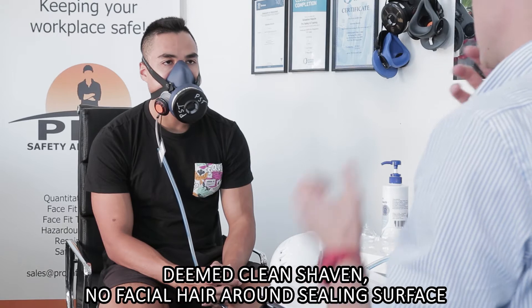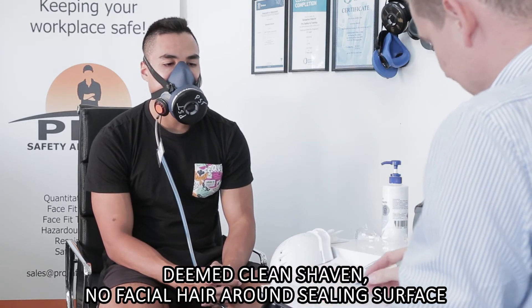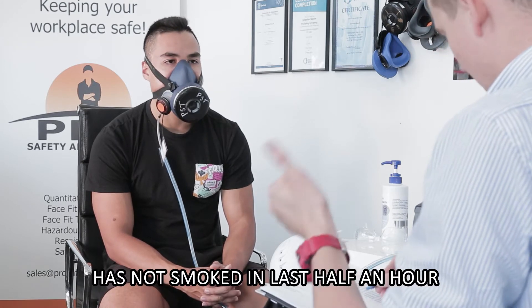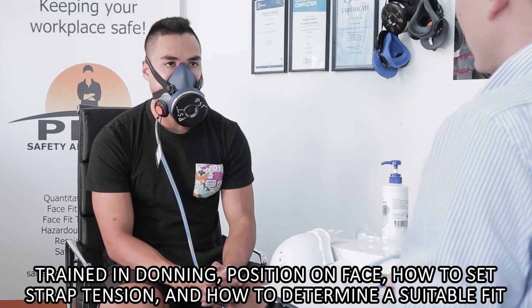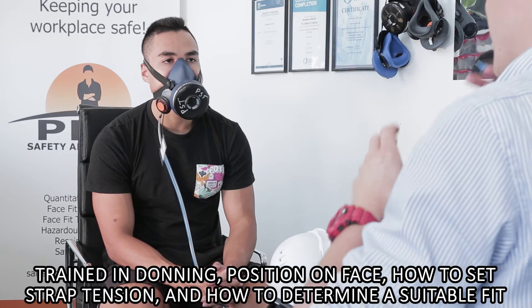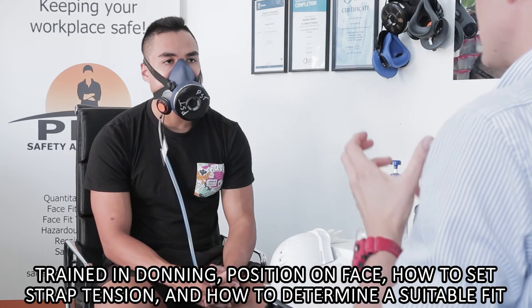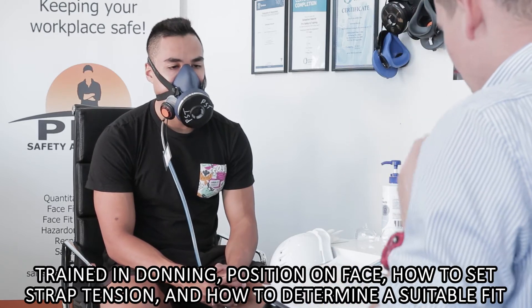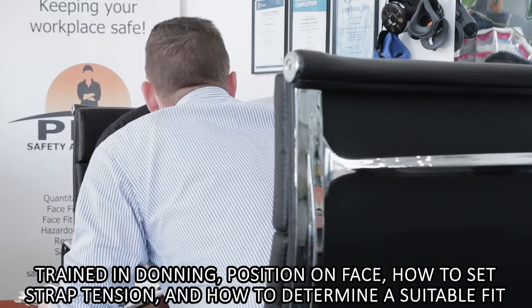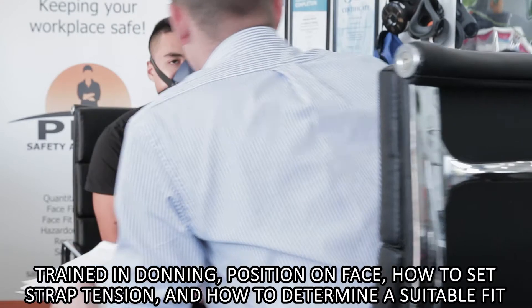You're deemed clean shaven — you have no stubble around the sealing area, no moustaches that touch the sealing surface, so you're definitely deemed clean shaven for the test. Have you smoked in the last half an hour? Absolutely not — you're not a smoker, that's really good. Trained in donning — we've given you guidance before on how to put the mask on. You've received training on how to don the mask, take care of it, select it, use it, and maintain it. So I'm happy with training in donning. You've gone ahead and put the mask on quite well actually. I'm just going to have a bit of a review — I'm happy with that. Just put your chin up for a second. I'm pretty happy with that, mate — you've got the straps in the right spots.